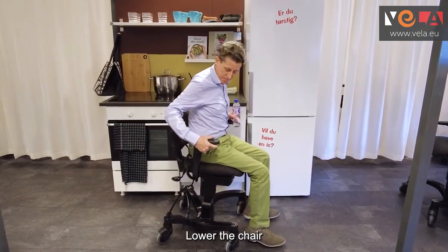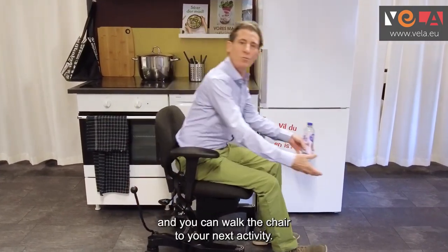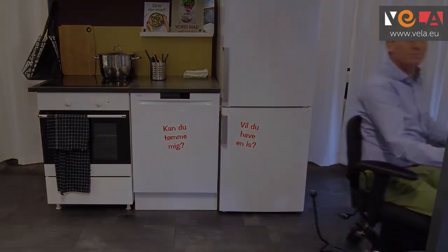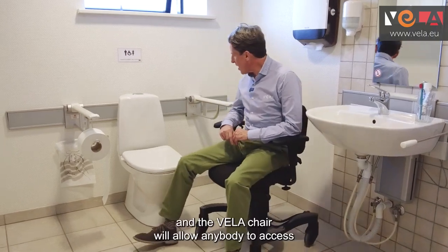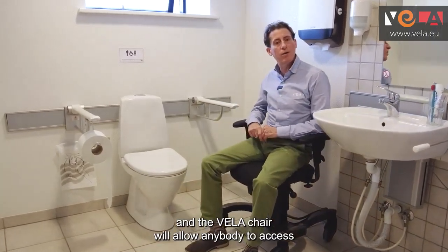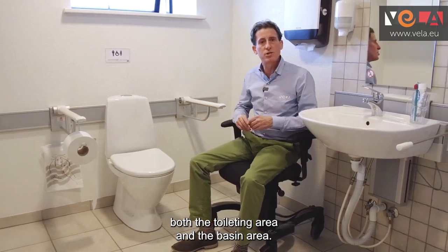Lower the chair, make yourself nice and comfortable, release the brake and you can walk the chair to your next activity. Here we are in the bathroom area and the Vela chair will allow anybody to access both the toileting area and the basin area.